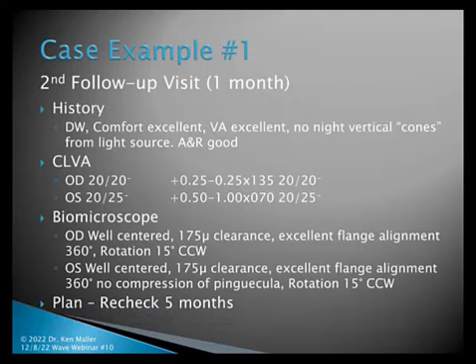Recheck in 5 months. So this case really does show that with fantastic fitting data, the first pair of lenses actually fit almost 100% of the way there. The right one, we were basically there, and the left one, other than the pinguecula and a couple little minor modifications to the edge, and then dealing with the nasal compression of the pinguecula, that just improved the fit that little bit extra that we needed to. The only thing that I needed those follow-up lenses for really was for vision. All right, let's go to the next case.